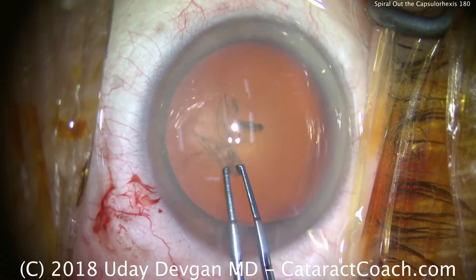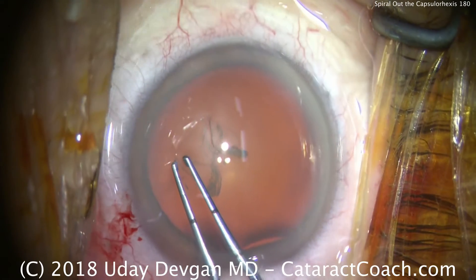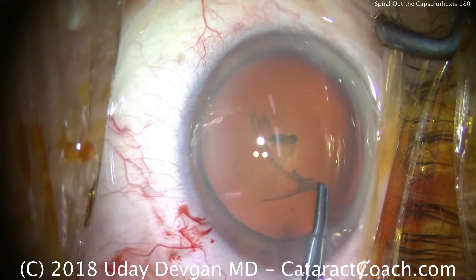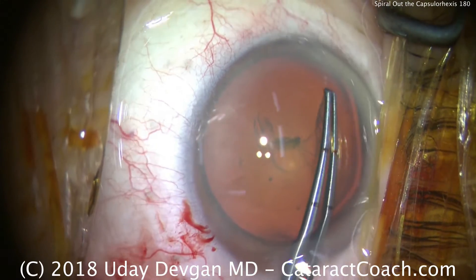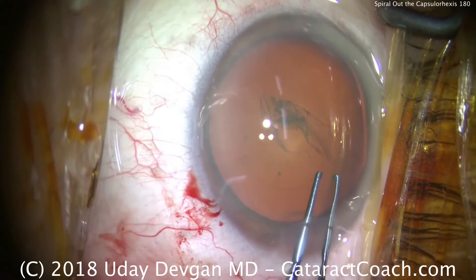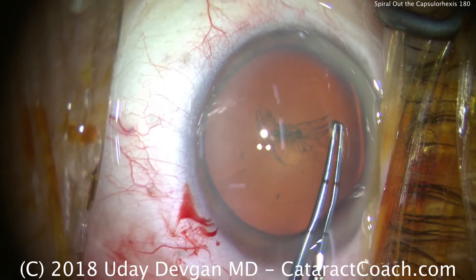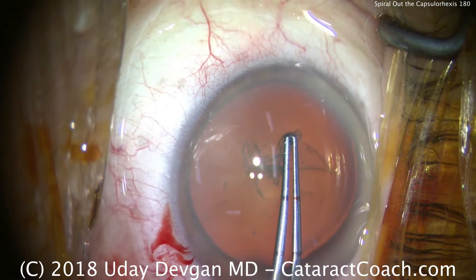A little bit smaller, and we spiral it bigger and bigger, and keep spiraling it outward until it's about the right size. Right about now, it's the correct size. So we'll keep grabbing it. Keep it the same size now — don't spiral it in or out. Keep it this size.